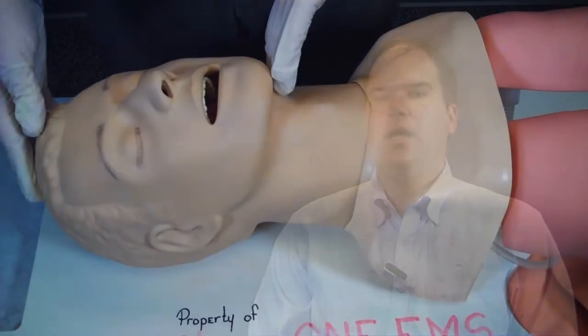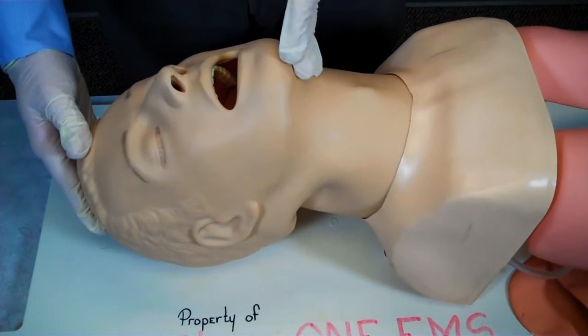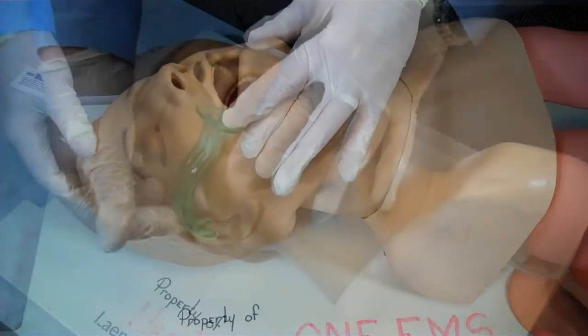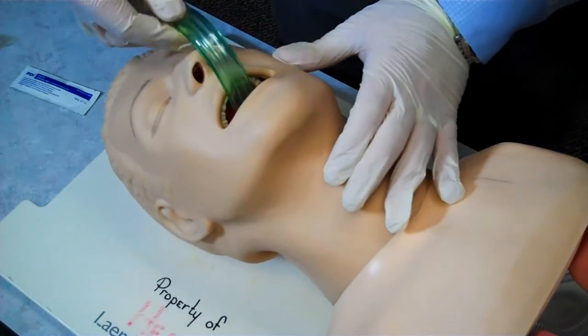I will now manually open the airway and ensure the mouth and oral pharynx do not require suctioning. I now elevate the tongue and insert a simple adjunct. This could be an oral or nasal pharyngeal airway.